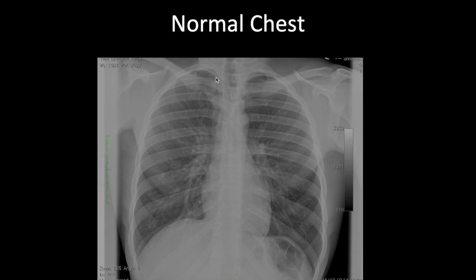The next thing is the inspiratory effort. You want to pull the diaphragms all the way down as far as possible so that you can see as much of the lungs as possible. You assess the inspiratory effort by counting the ribs. These are the posterior aspects of the ribs, and these are the anterior portions which come down. Five to eight anteriorly, or nine to eleven posteriorly, would be adequate for a good inspiratory effort.